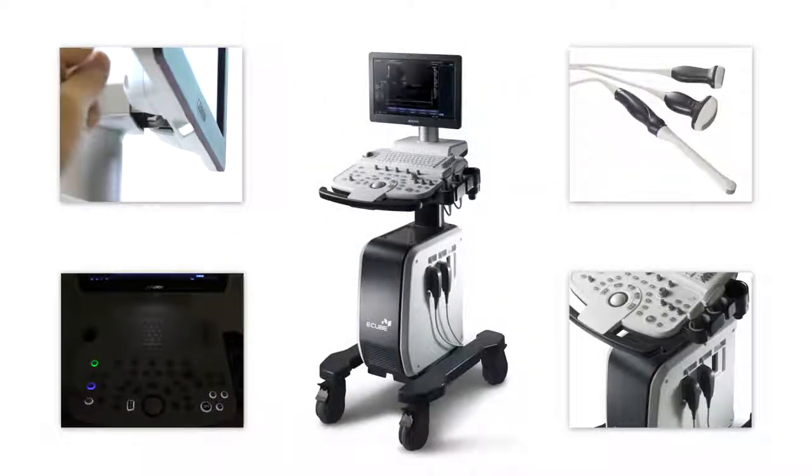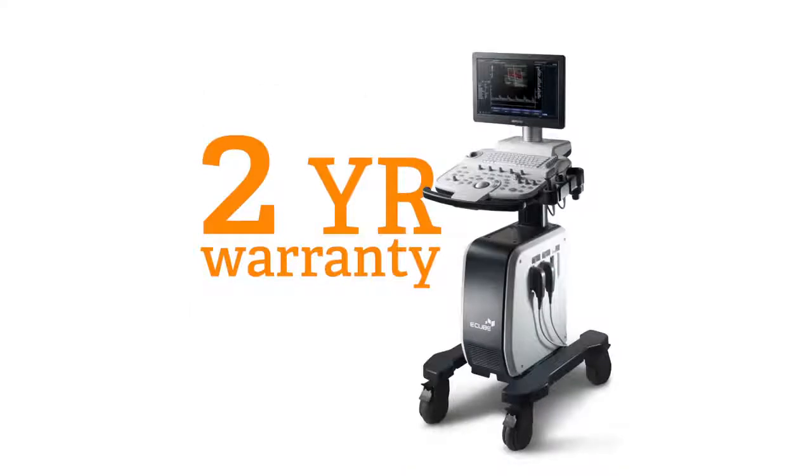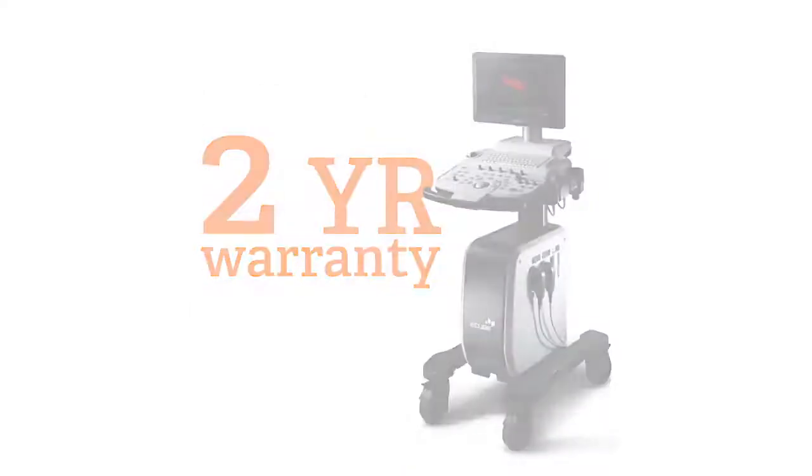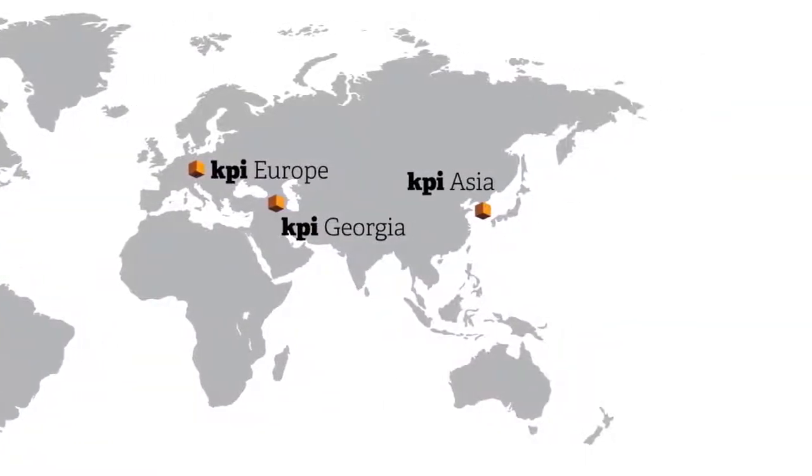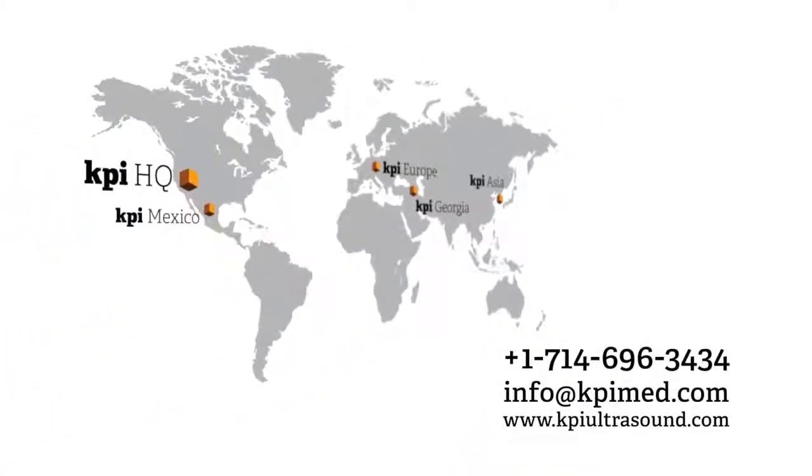Alpinion is not a well-known brand yet, but this FDA-cleared system comes with a two-year warranty to give double the peace of mind of most new systems. So compare the E-Cube 5 with your existing ultrasound machine or any major brand's premium entry level, and be prepared to be pleasantly surprised when you see what it can do and the money you'll save.